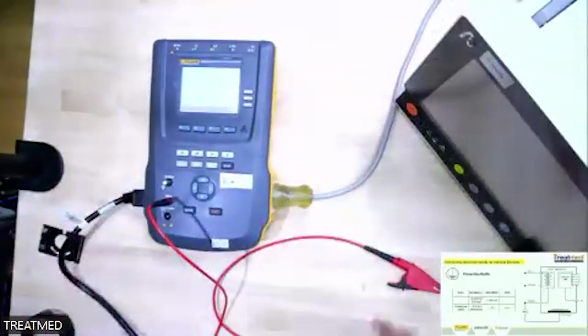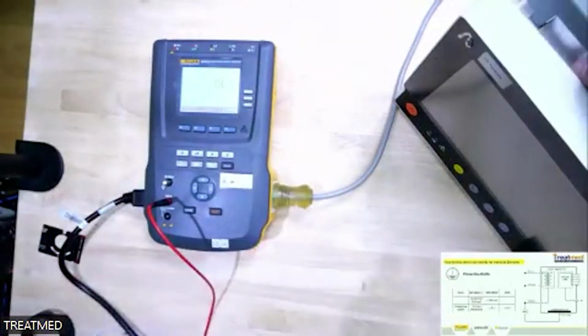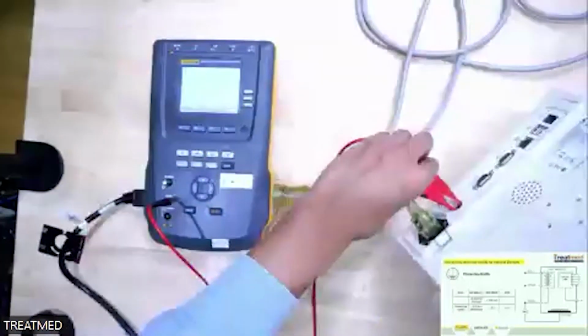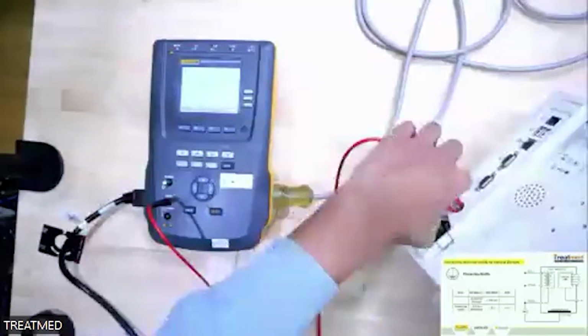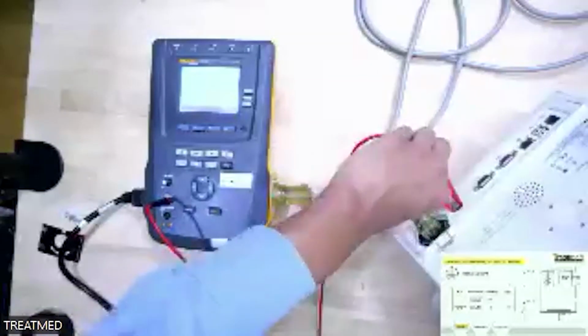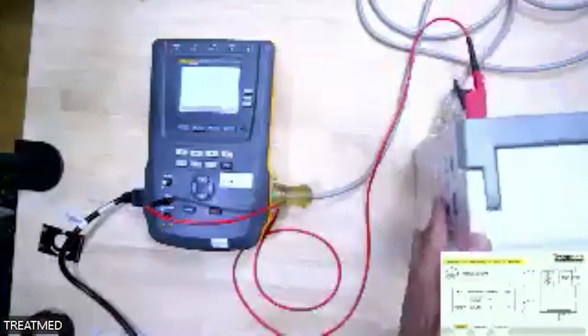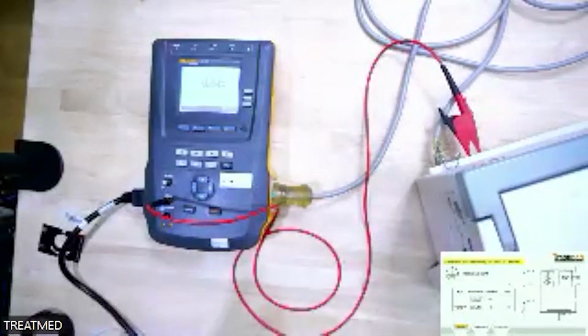Yes, and then for the red wire, we connect to the protective earth at the back of the medical device. This connection is for class 1 medical devices. For class 2, it is not necessary to measure the protective earth.